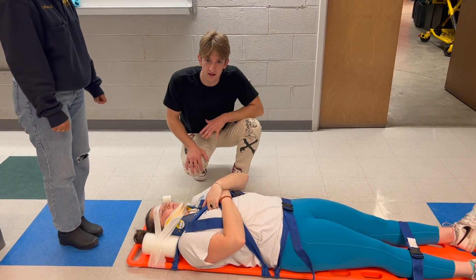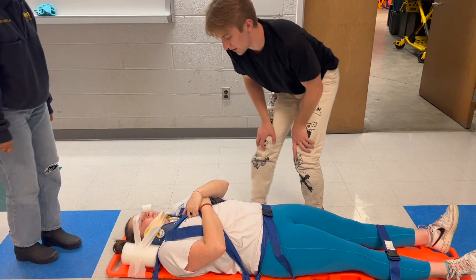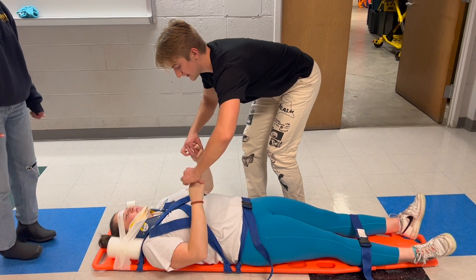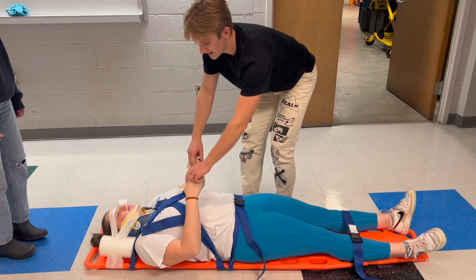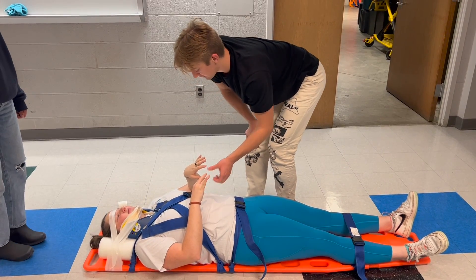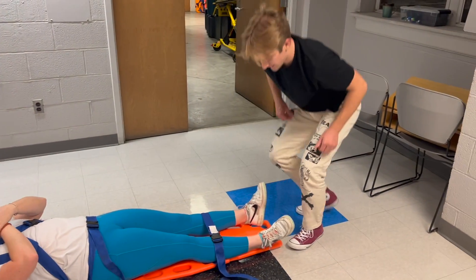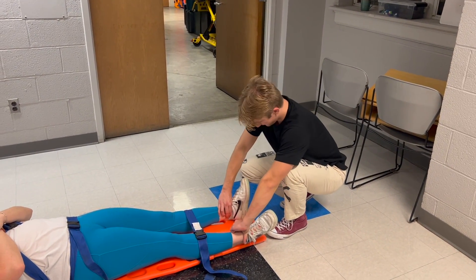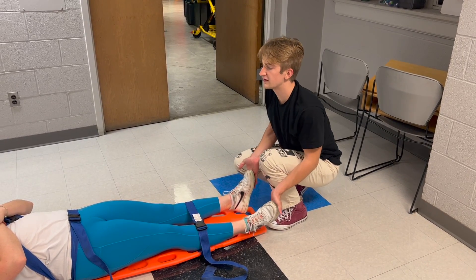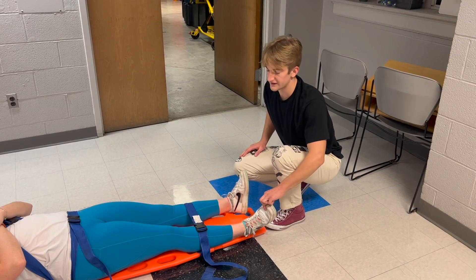I will complete the procedure by checking PMS on all extremities — it's the same process as before. I'll feel for pulses, ask the patient to squeeze bilaterally, and then on each side ask if they can feel which finger I'm touching. I'll also feel for pedal pulses, ask the patient to push down with both feet, pull up with both feet, and one at a time identify which toe I'm touching.